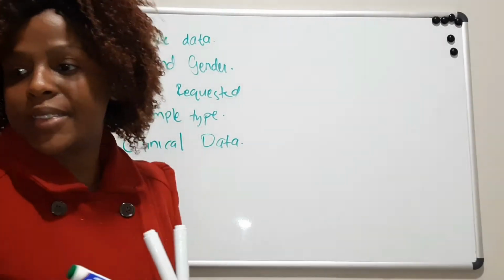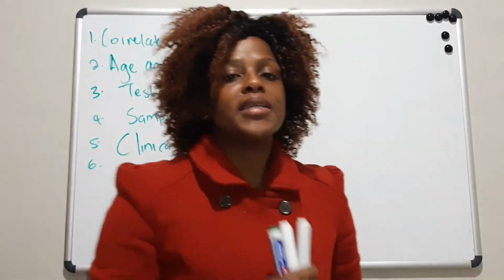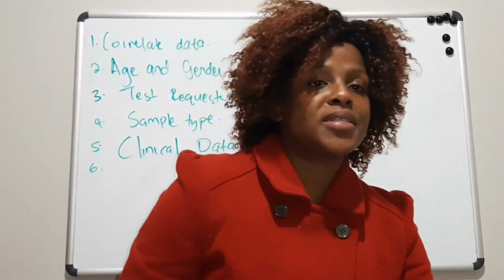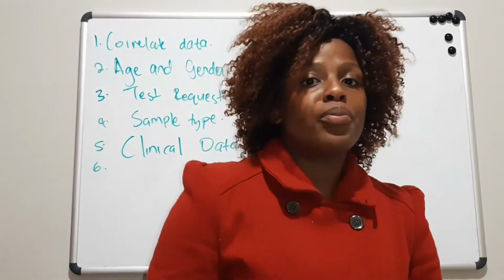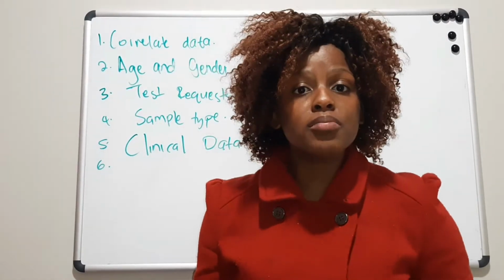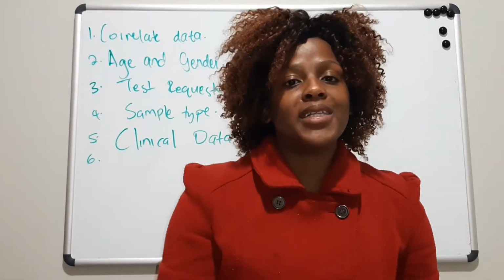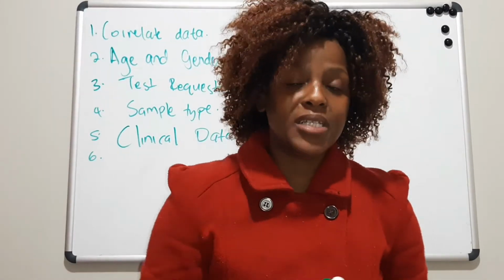So that will be the clinical data of the patient. And then another thing is the time of collection that needs to be taken into consideration. What time was this specimen collected, before you received it? Because certain tests, when you do them on old samples, maybe samples that are greater than 12 hours, greater than a day or two, you find that the stability of that test starts to decrease, and then you can end up having erroneous results, or results that are not correct.